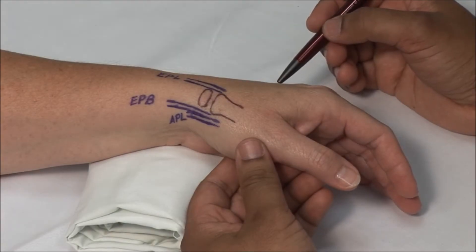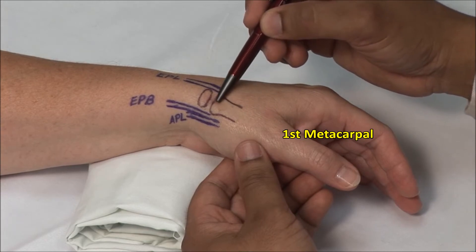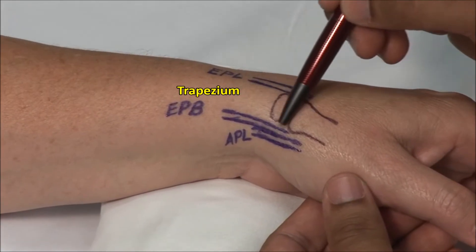The first carpometacarpal, or CMC joint, is located between the proximal tip of the first metacarpal and the trapezium at the distal border of the anatomic snuff box.